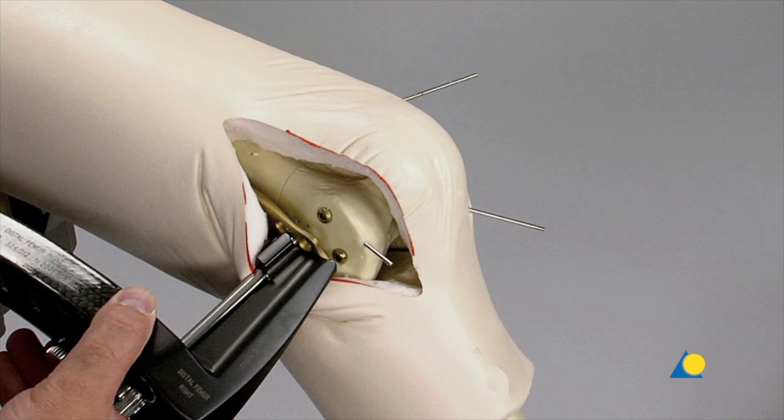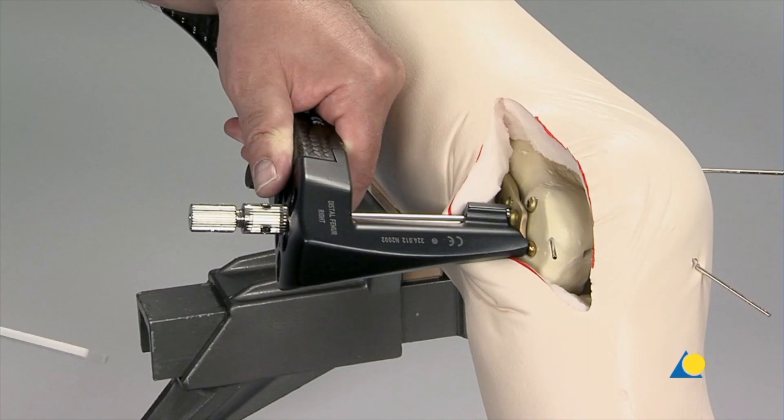An anterior gap between the plate and the bone must be avoided. This would cause pain to the patient as the tractus ileotibialis is irritated. This gap is created if the surgeon tries to position the plate in an orthograde fashion and does not orient the plate to the bone surface.